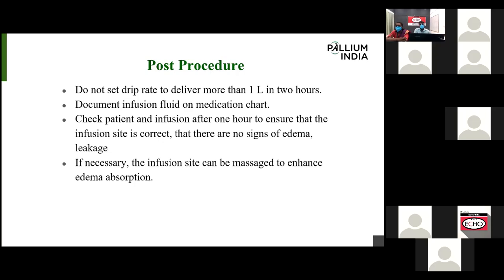Then, if necessary, if the area has so much edema, a mild massage can be given for edema absorption. If again we notice edema on that area, or the patient is having any distress, we need to change the area. Otherwise, mild massage is helpful for the edema absorption.